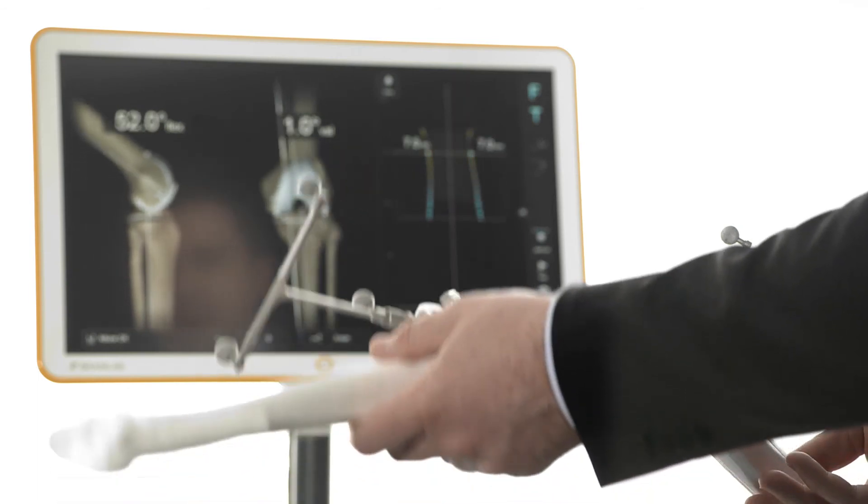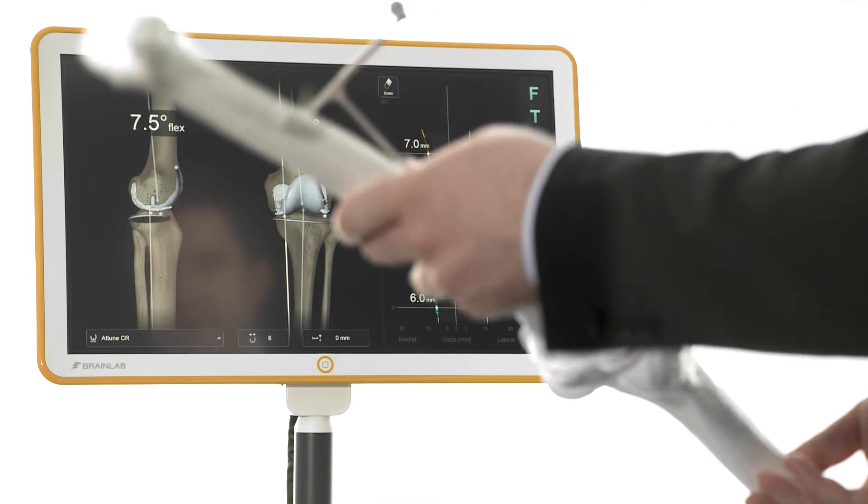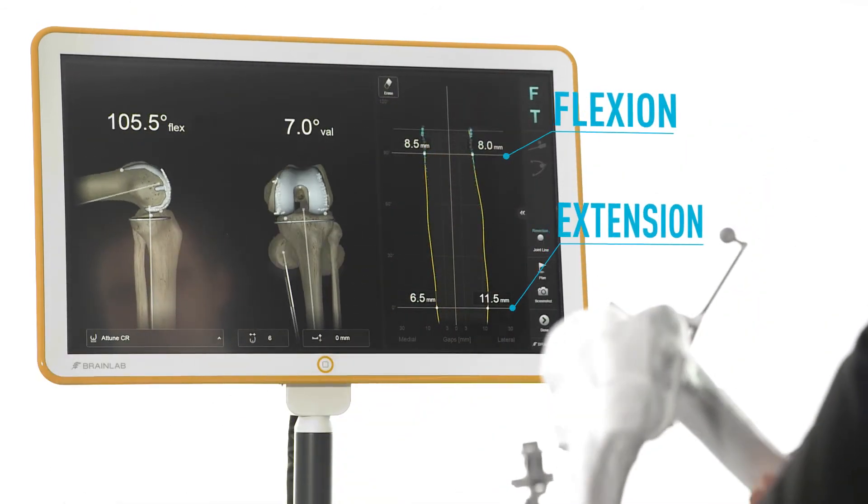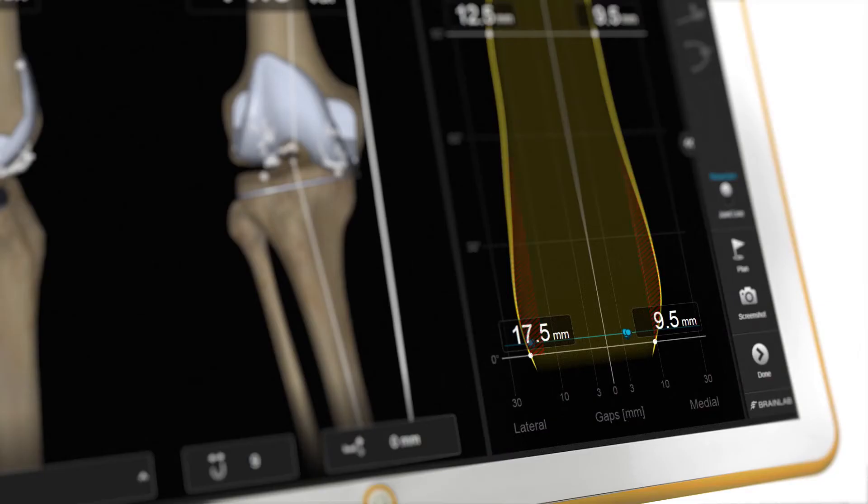Once the registration steps for femur and tibia are finalized, the initial assessment of stability and leg alignment can begin immediately. As the leg is moved from full flexion to extension, the balance graph on the right side of the screen is created, providing information about the stability of the joint based on the selected implant family even before any bone cuts are made. Potential instabilities or deformities that may have an effect on further surgical steps can already be identified at this stage.